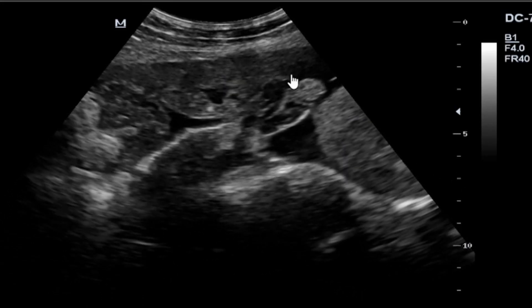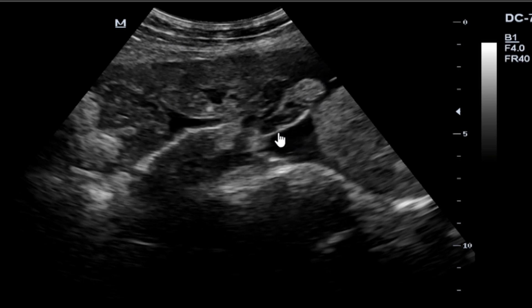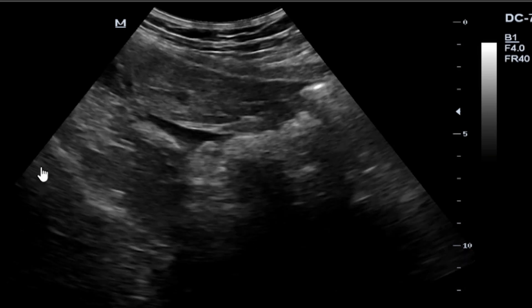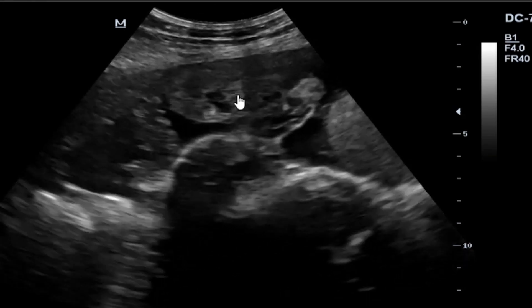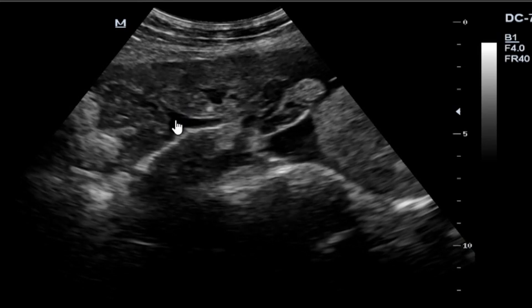Our uterus is down here, and you can actually see here is part of the umbilical cord that is actually going to the fetal abdomen, but there was no flow here. You can see free fluid right around here, and you can see that the uterus is attached somewhere here to the abdomen. This part is non-viable.